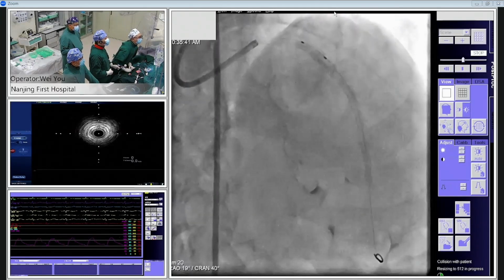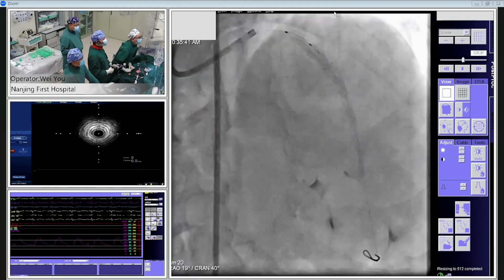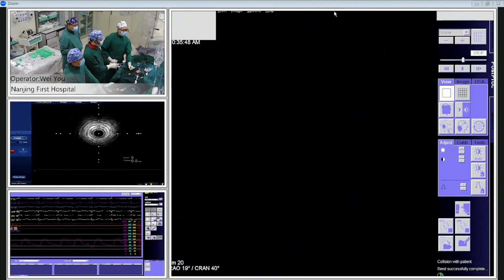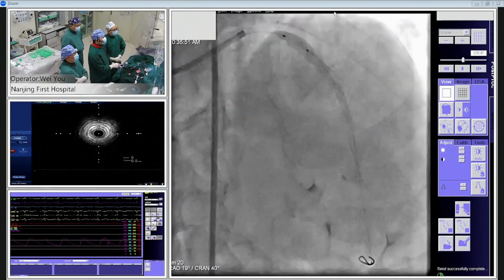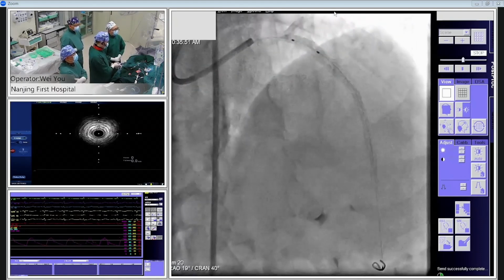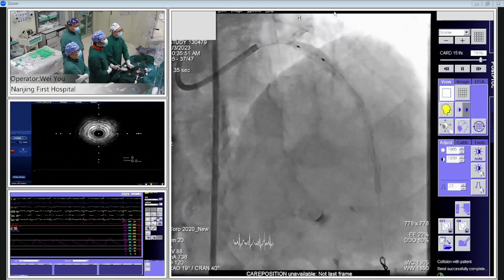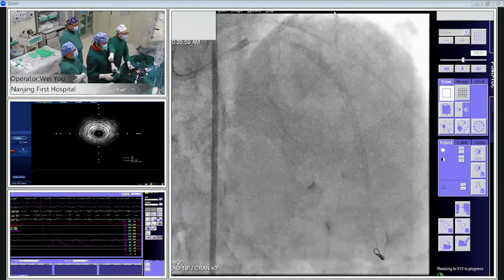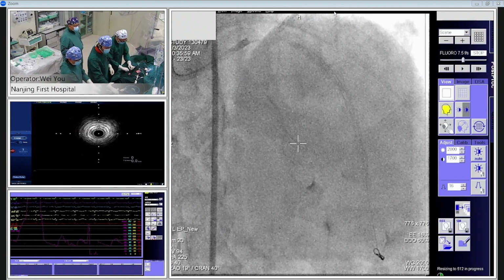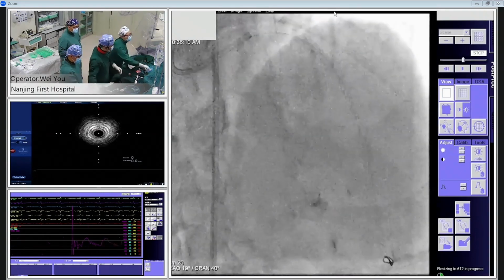This is the proximal segment. Just touch. Okay, go 16, please. Position, precisely position is very important. Okay, 18, 20. Okay, done. Seems like the balloon expanded well. Very good expansion. Okay, I will give some nitro and take the picture.